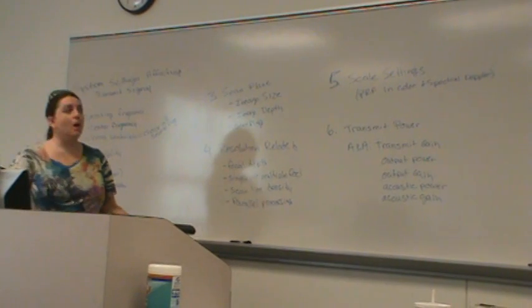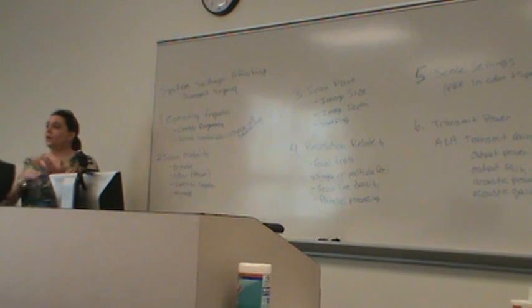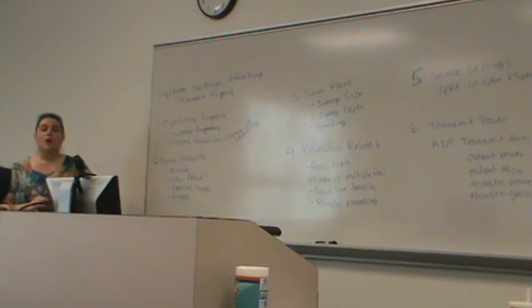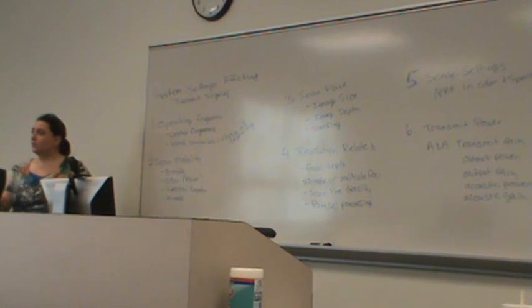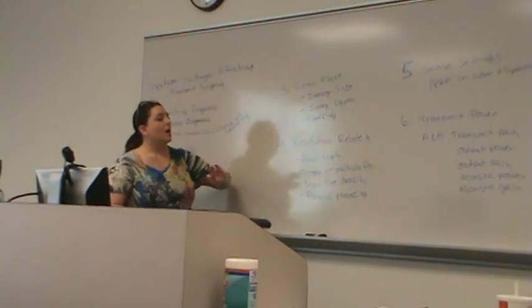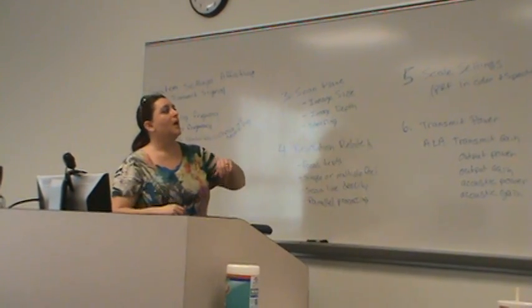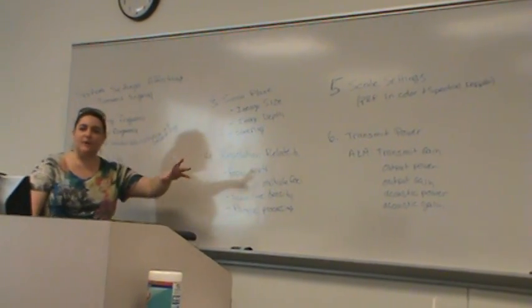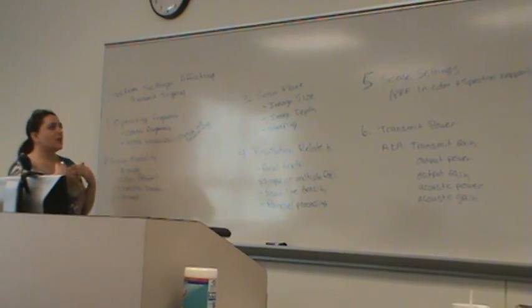Okay, so all of this stuff, we sit down, and you do all this, right? You sit down at the machine, and you figure out what transducer am I going to use, what preset I'm going to use. The preset predetermines a lot of this information. And then you pick which modality I'm using. You push those buttons. So I'm just going to do B mode right now, or I need to add color. I'm going to change my depth depending on what I'm looking at. I'll change where my focal point is depending on what I'm looking at and what area on the screen it's at. If I have color or spectral Doppler on, I'm going to adjust the scale appropriately. And maybe if I need to, I'll go find that transmit power. Most of the time we leave transmit power alone, but it's there if we need it. So this is kind of what we do when we sit down.